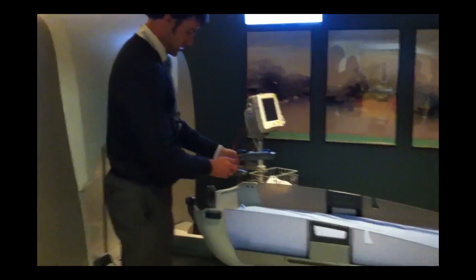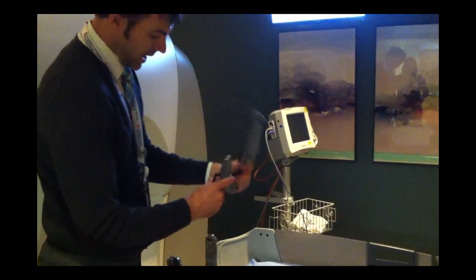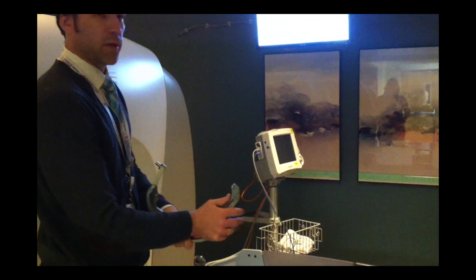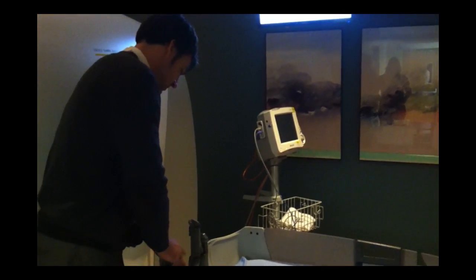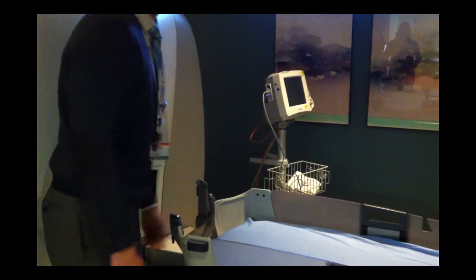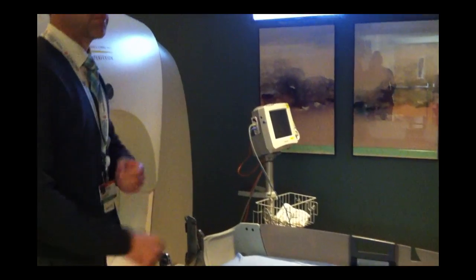The frame locks in so that the head becomes one with the machine frame. Once it's locked in, there's no movement. If the patient tugs significantly, the machine will sense it and throw a fault, driving them out of the machine as a safety measure.